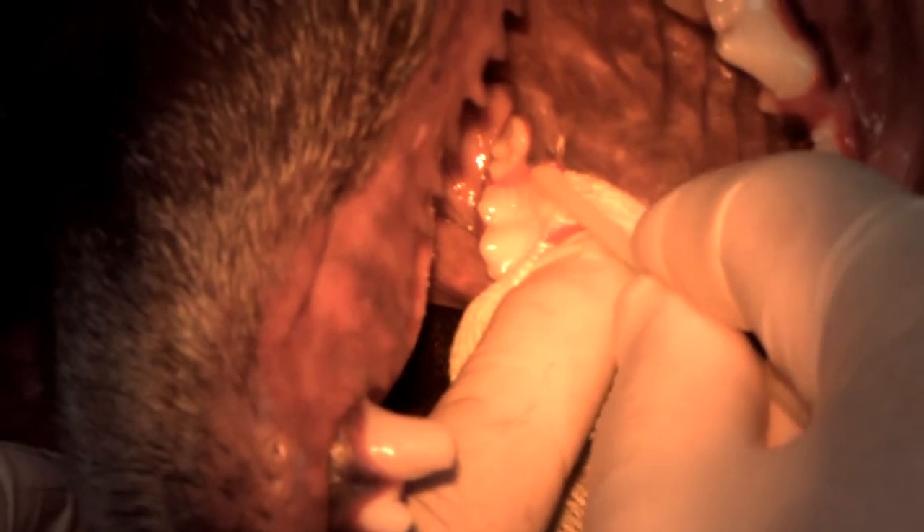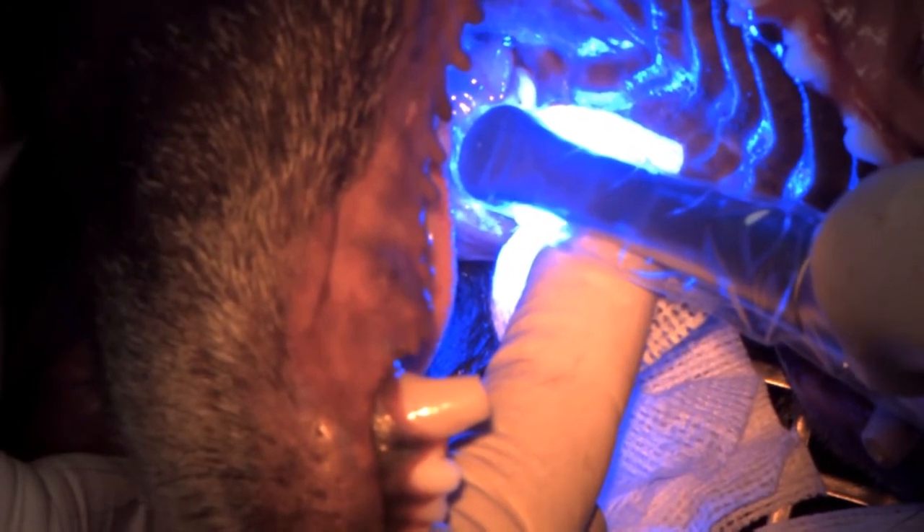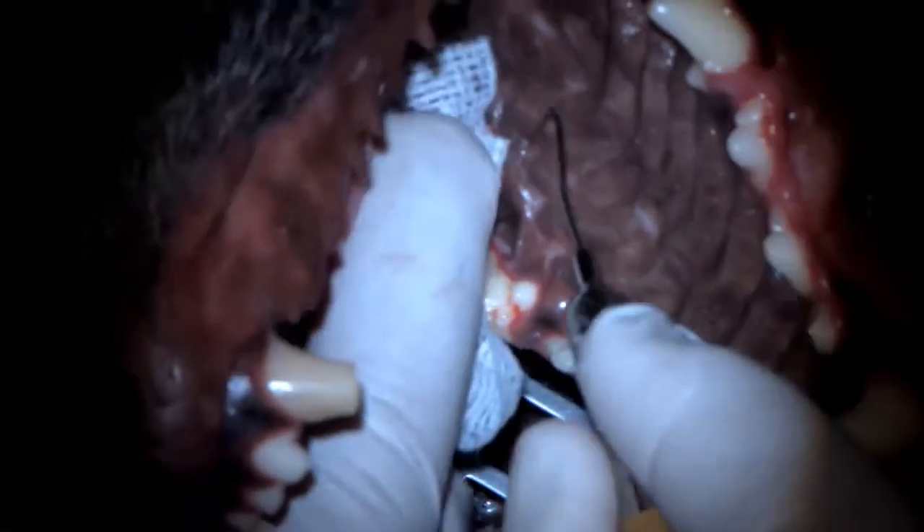Then another coat of bonding agent over the restoration and the surrounding tooth to fill any little irregularities and create a nice, smooth, polished finish. This curing light has various modes — I'm using the three-second mode and giving it two doses of three seconds for curing. Now I can lift up my orange filter. The surface is smooth, no catches at the margins. So that's a drill and fill for a small caries lesion in the left maxillary first molar in a lab.